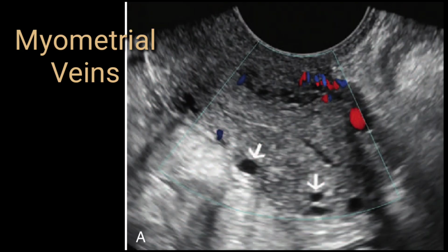So let's start watching these images. Here on this ultrasound imaging, this is actually a TVS scan, and the uterus is retroverted. On this retroverted uterus, you can see the endometrium, the myometrium, and myometrial echogenicity.